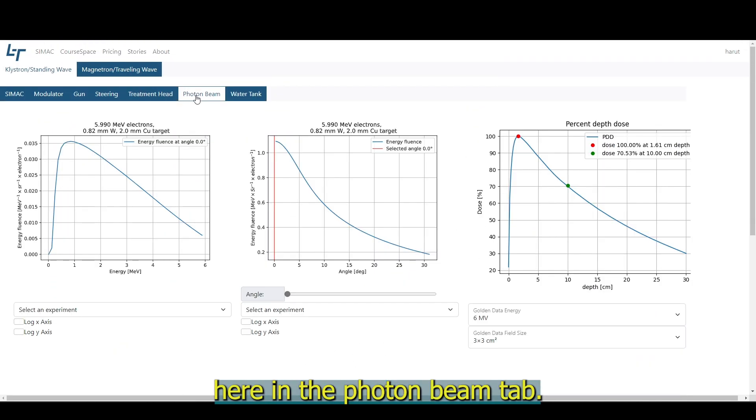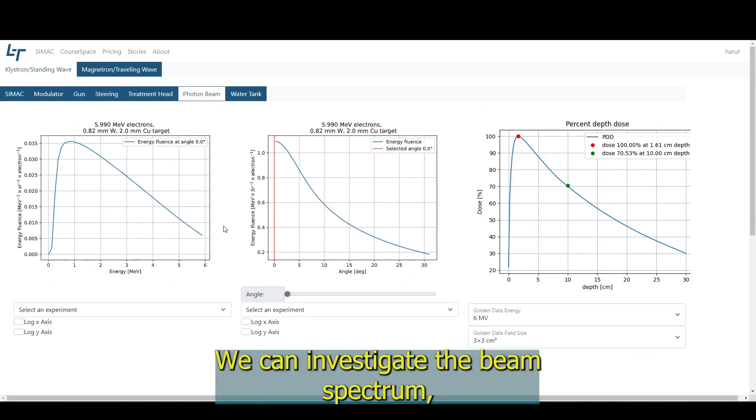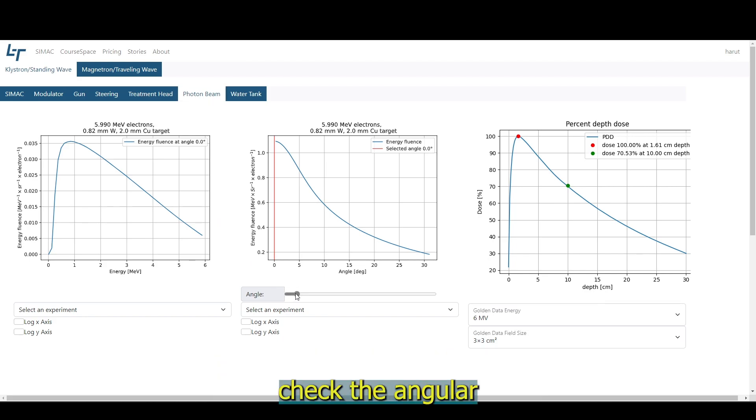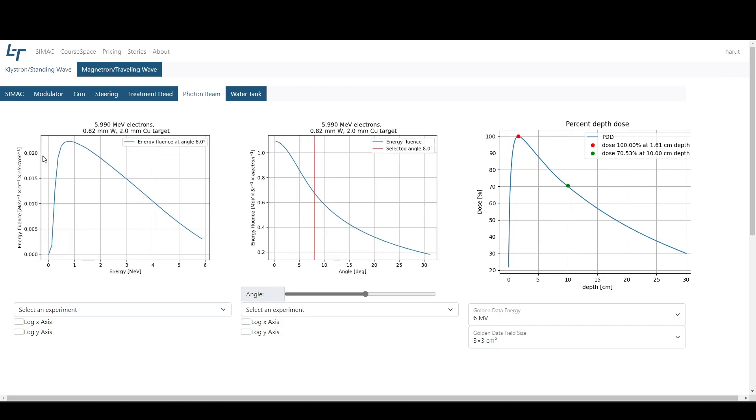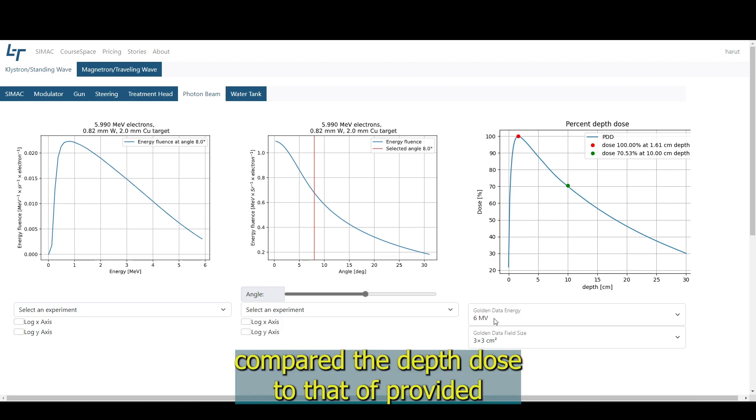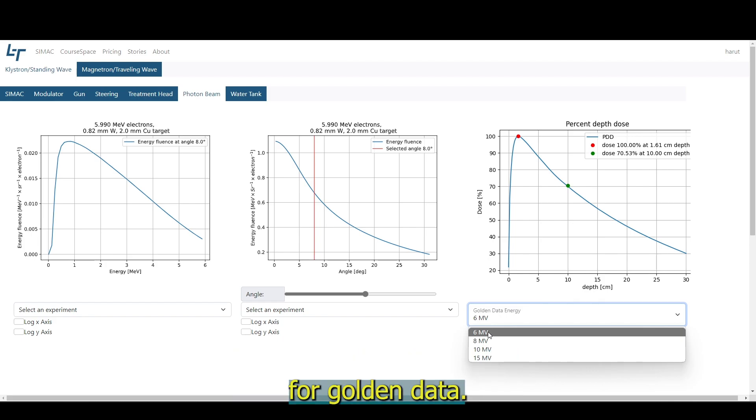Here in the photon beam tab, we can investigate the beam spectrum. Check the angular distribution of the beam. Compare the depth dose to that of provided for golden data.